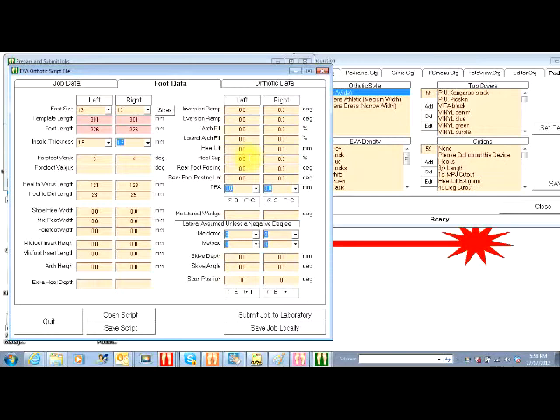You generally don't need as high heel cupping as you've used with the polypropes, but that's what you can do with that. Rear foot posting is, generally speaking, the difference between the rest and neutral stance position with our devices and the way the program's been written. If you measure those two and work out what your distance is, that's the right way to go. If they supinate, use rear foot posting. Because we conform to the arch so well, you do need a PFA.